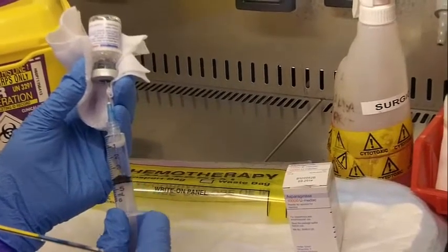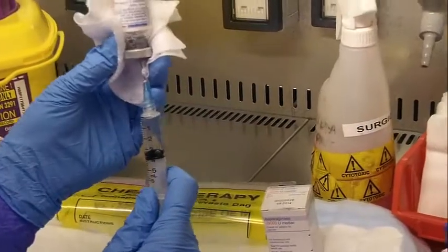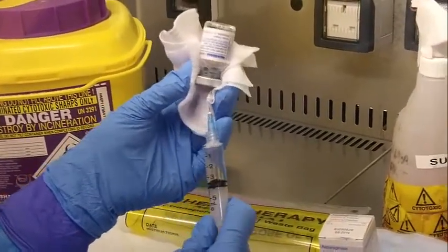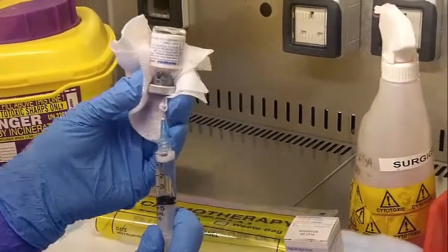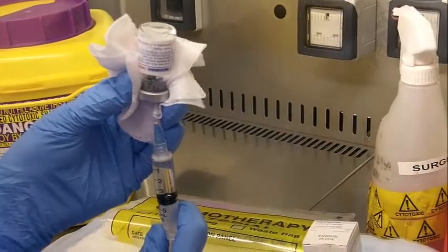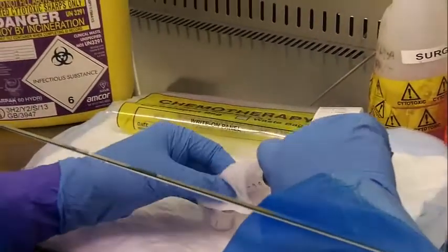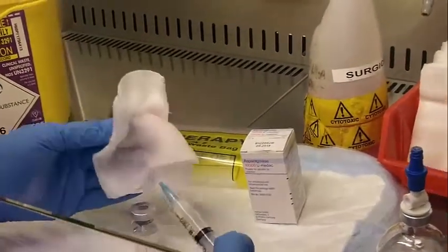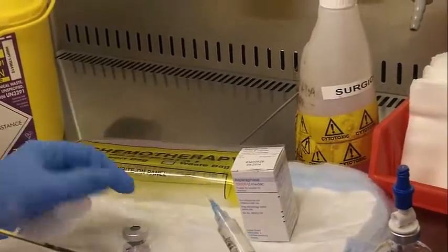This method would be the way you would draw up any liquid for injection, regardless of whether you're having to make it up from a powder or if it comes already in a solution form. So you always draw out your volume, and you always want to re-invert your vial and wrap your swab around, and then pull your needle out. If any aerosol droplets do come out as you pull your needle out, they're trapped in that swab.